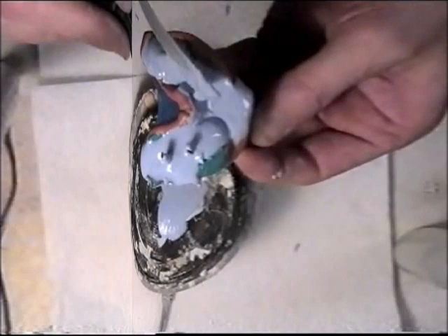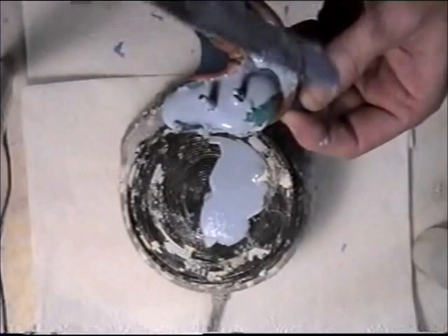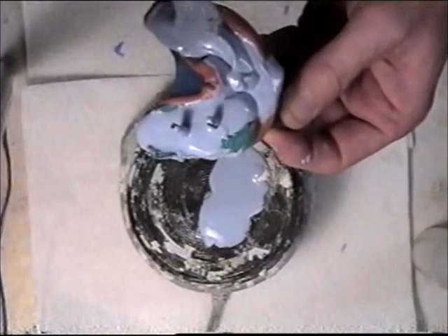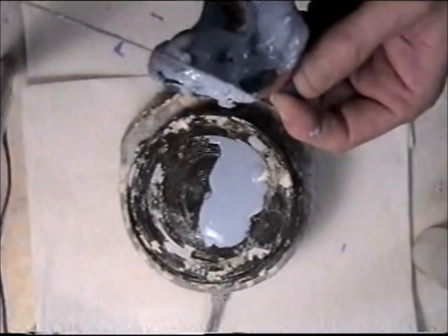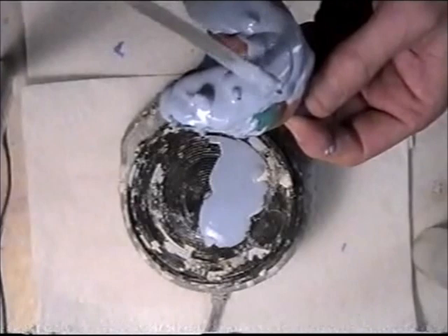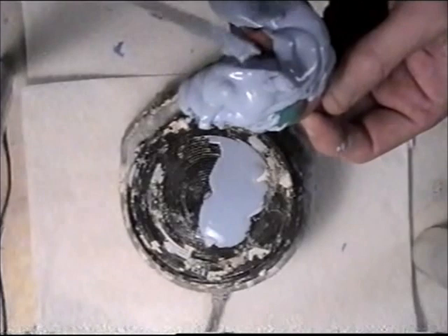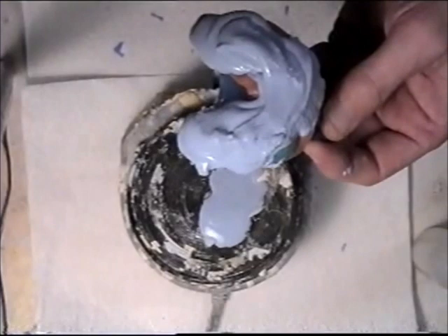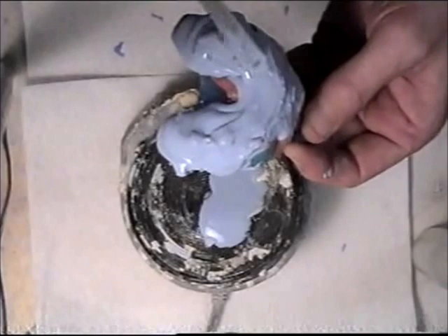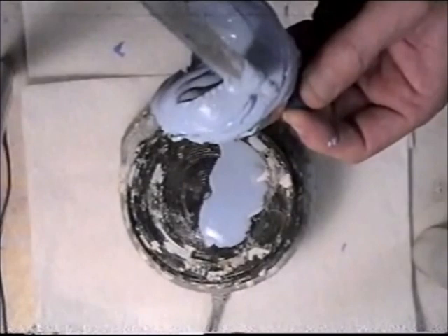Now, what I need to concentrate on is making sure that I put all the excess stone that I can around the analogs and on top of the analogs. I have to build up this region and cover these analogs completely. And I have to make sure that the other side of the model is going to be parallel in height. But it's critical that you do cover these up.